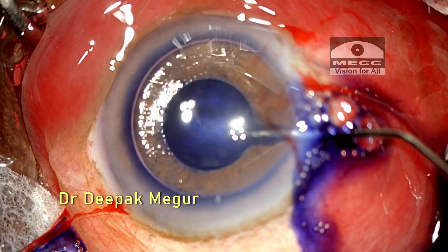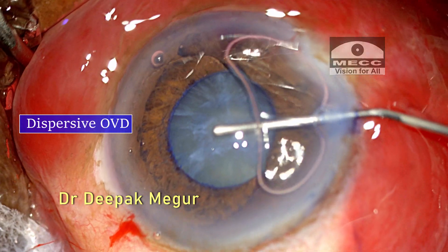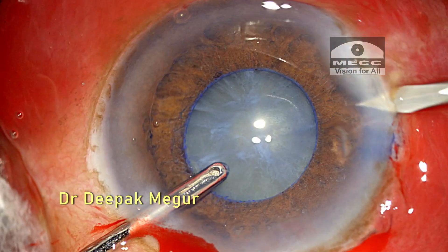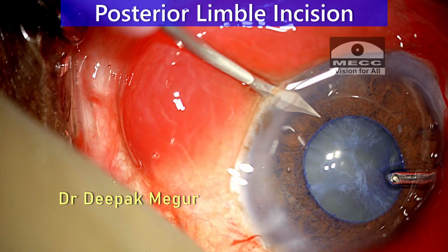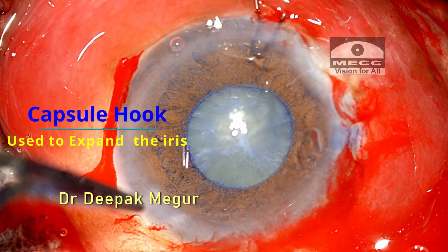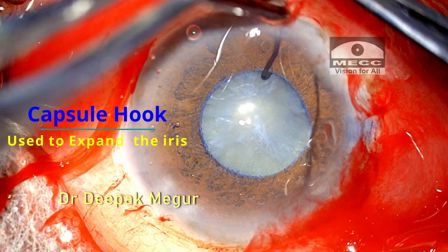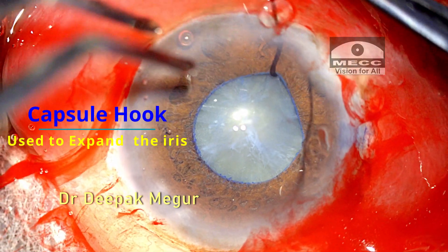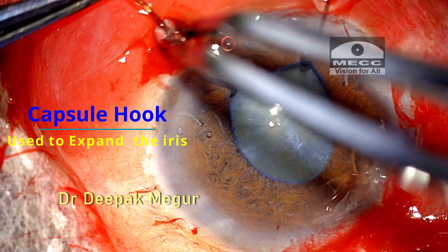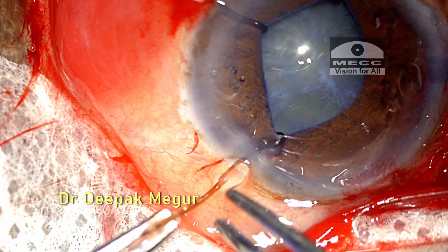After making the side port incisions, the capsule is stained and the chamber is filled with OVD. I want to use hooks for pupillary dilatation, so I make posterior limbal stab incisions. I'm consciously using capsule hooks instead of iris hooks as a pupillary expansion device — the idea being that I would use the same hooks to stabilize the capsular bag if needed, as I'm expecting a weak or loose bag in this eye. At this stage I'm not pulling the pupil with these hooks, just keeping them engaged.